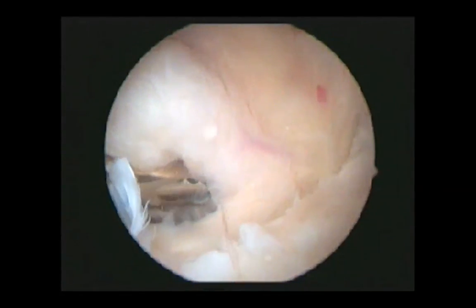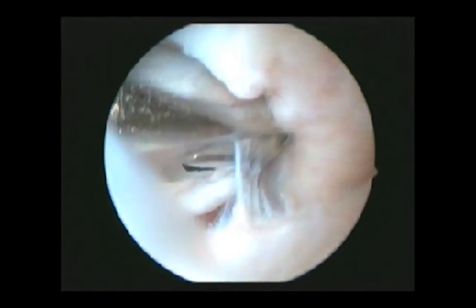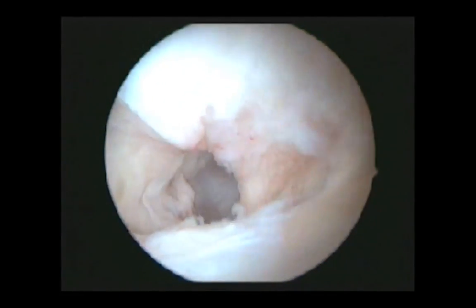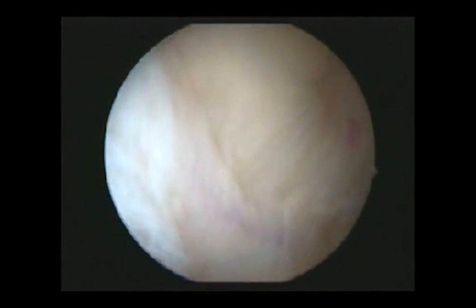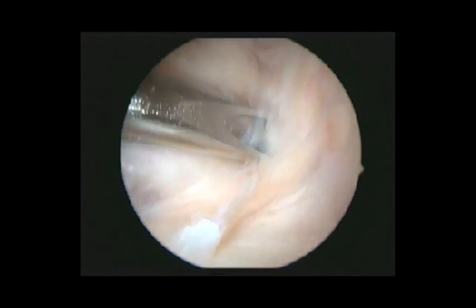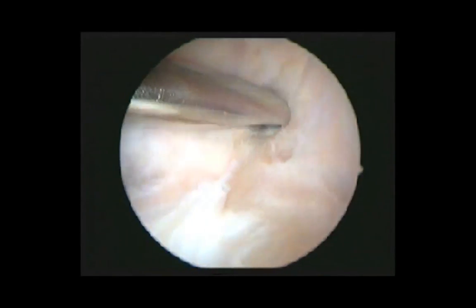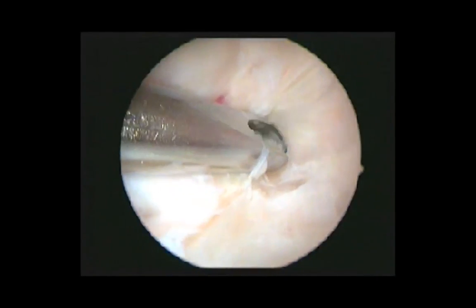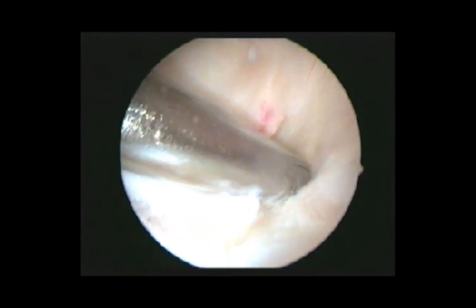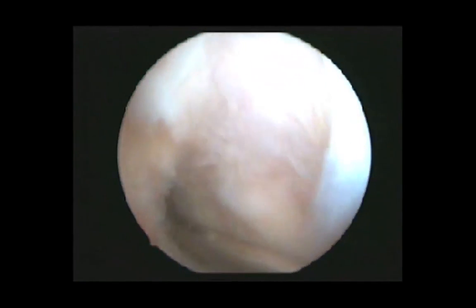Now the shaver is passed between the lateral surface of the medial femoral condyle and the PCL to debride the cyst wall from this interface through which the cyst has extended from the posterior surface anteriorly. We are now creating a transeptal pathway to the posterior compartment of the knee. The shaver is to be used very cautiously in this region because on the left there is PCL and on the right there is insertion of the ACL on the lateral femoral condyle. Once we have a track, we expand it using a probe.